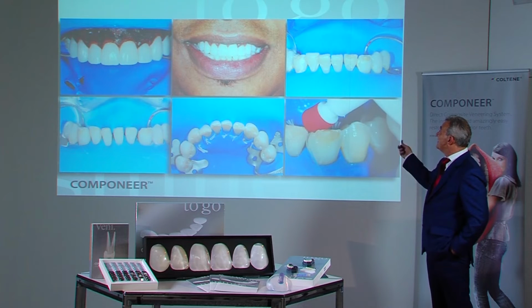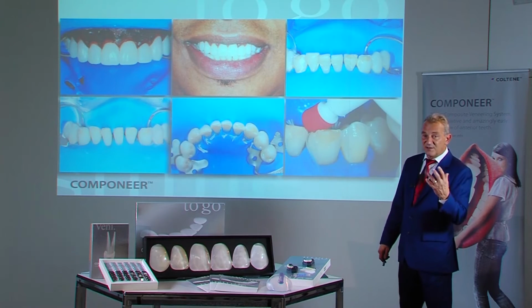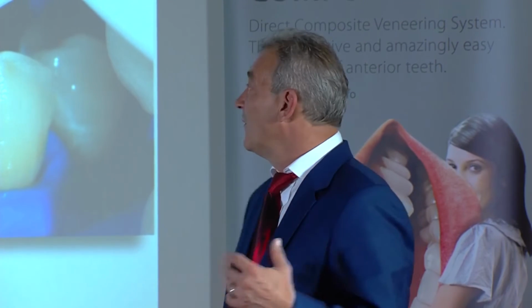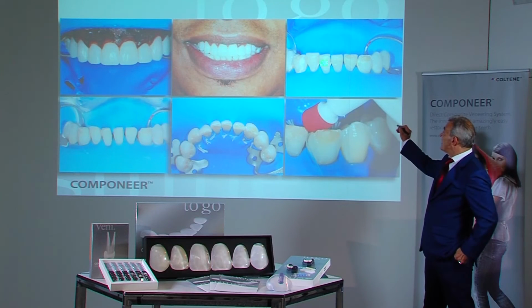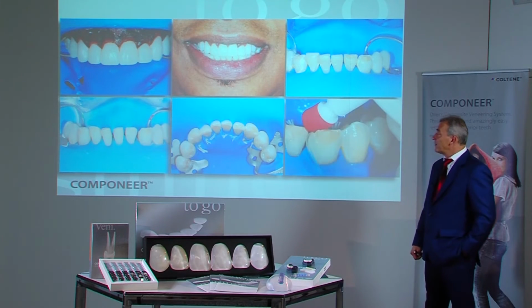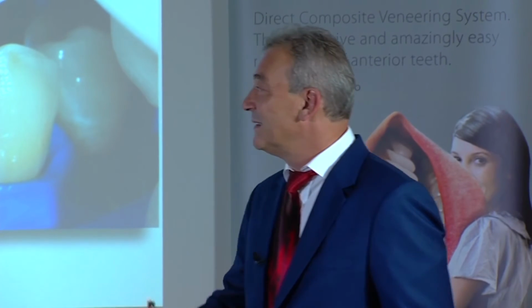In the top right of the image, one can see well that deposits are often difficult to spot when the teeth are wet. But that is misleading. Calculus can often have the same color as the teeth themselves. In a dry work field, you can then suddenly see, oh yes, there are still deposits on the surface. These need to be removed as the bonding would otherwise stick to the calculus. This is possible, but calculus does not adhere to the tooth as well as bonding to the calculus. Therefore, it makes sense to remove the calculus.